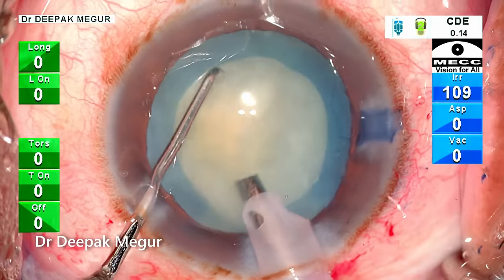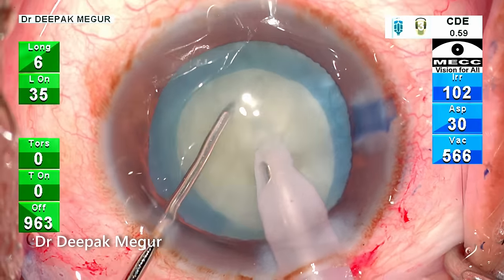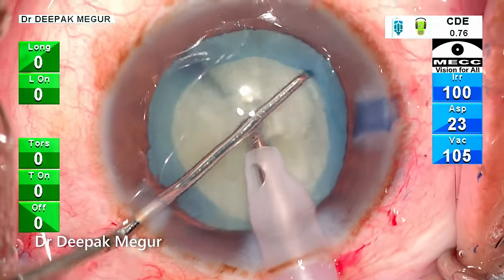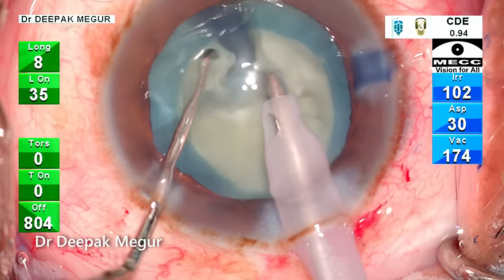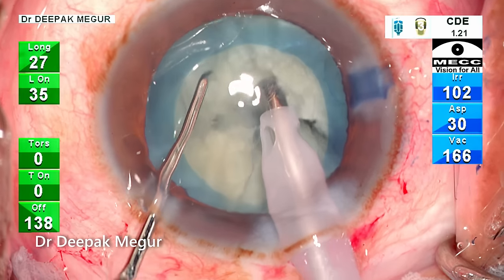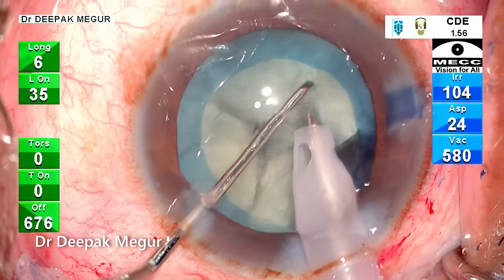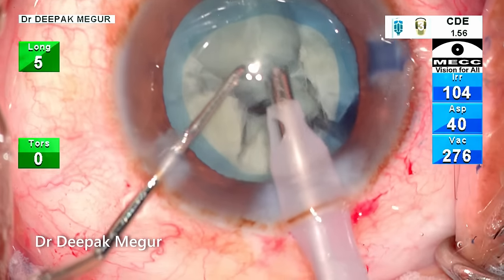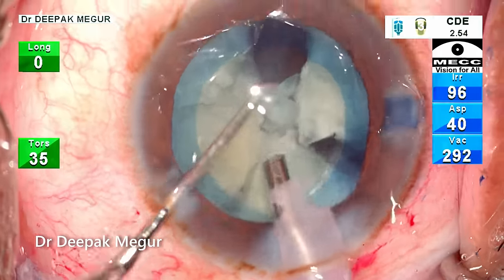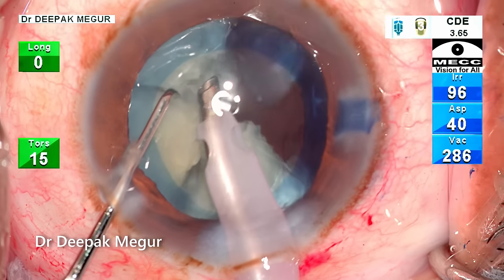The settings are now switched to the chop mode. The tip is buried into the substance of the nucleus. The sharp chopper is used to create a vertical chop followed by a lateral separation. It's very obvious that the nucleus is quite soft and I need to be careful to use less energy to bury the tip. The nucleus is divided into multiple small fragments and now switching to the quadrant removal mode, using very low power.